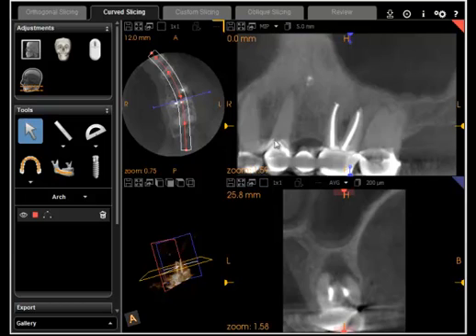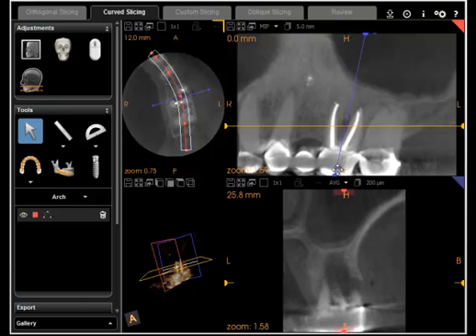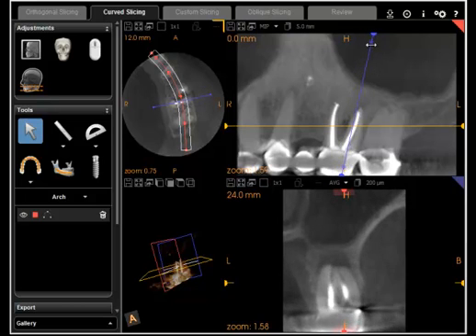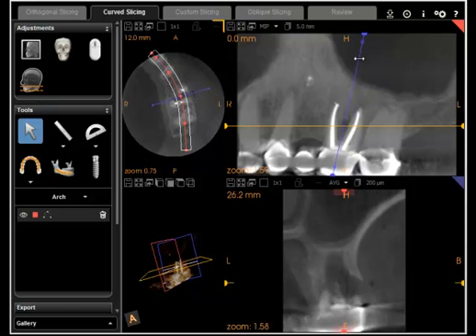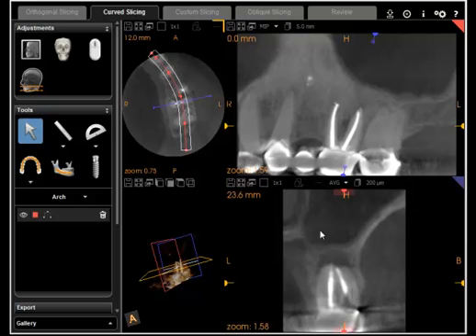In this particular scanned area, not only can we move the slice back and forth, we can also change the angle of it. If you hold the left mouse button down over this circle it becomes a four-way arrow, and you can line it up with the region of interest — in this case the fused distal buccal and palatal roots on this tooth. Once you've changed the angle, moving the slice back and forth usually illustrates the anatomy better.